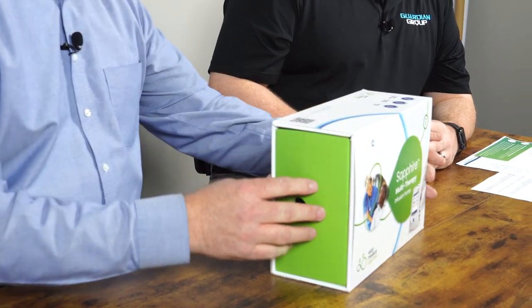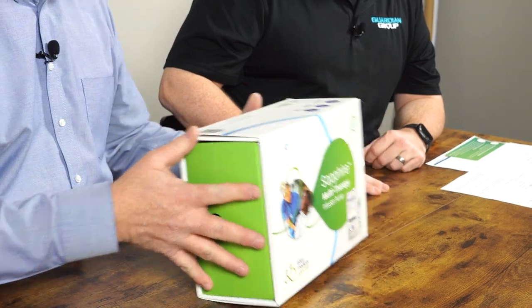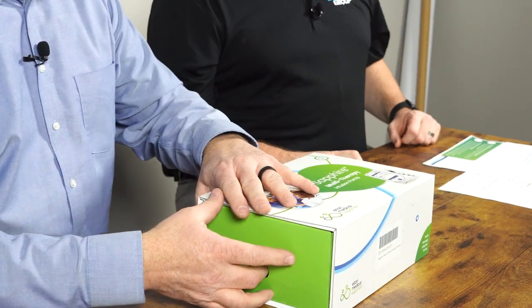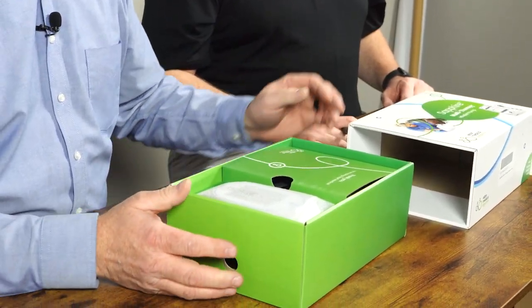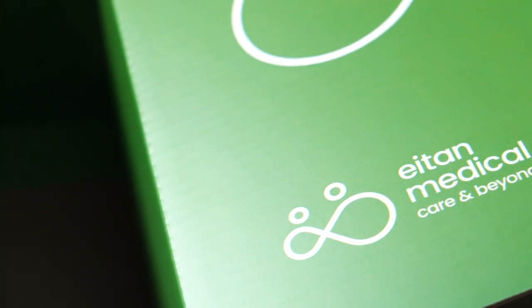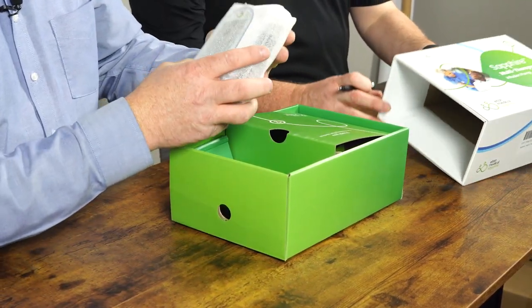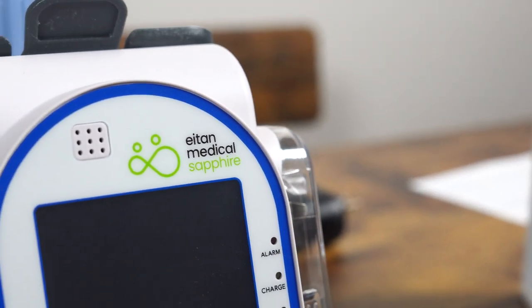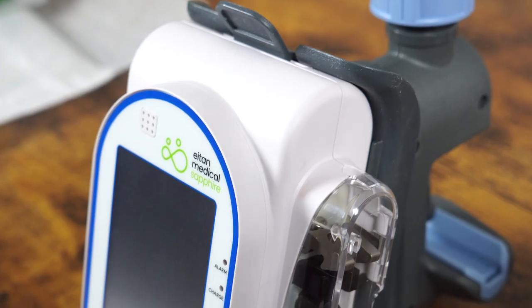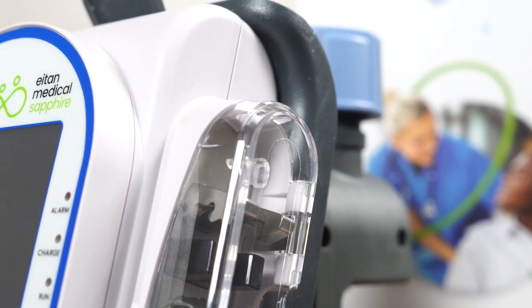This is the box you will get with a new pump, and we're just going to go through it and highlight some of the features. These pumps are made over in Israel by the manufacturer Eton Medical, and that is a great group to work with. Inside the box, you've got the pump itself, a cradle for securing the device, and a charging cord.